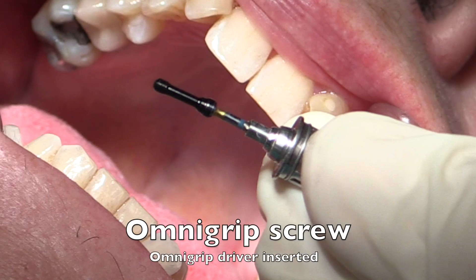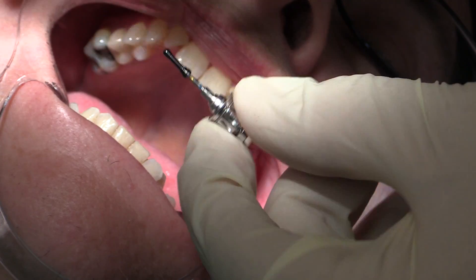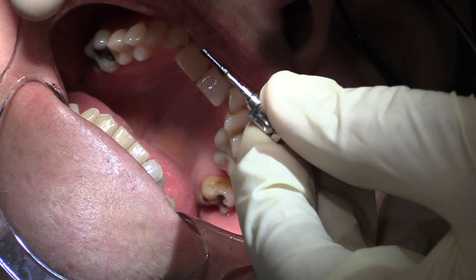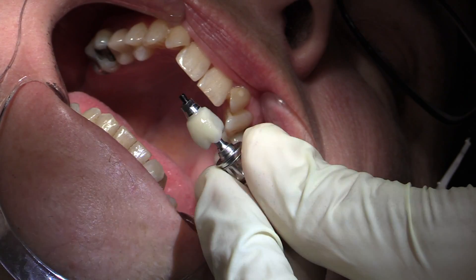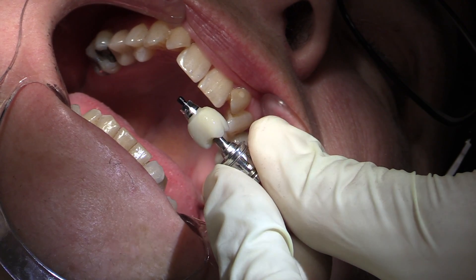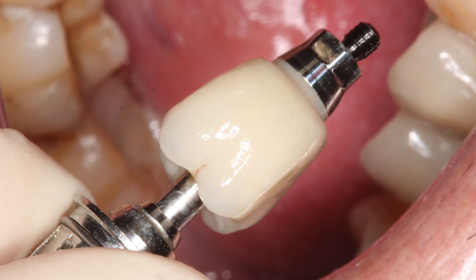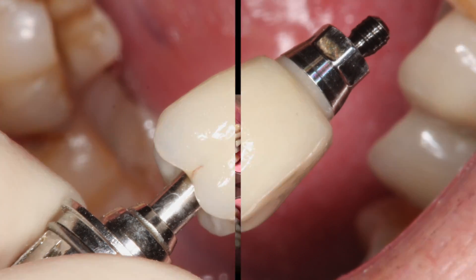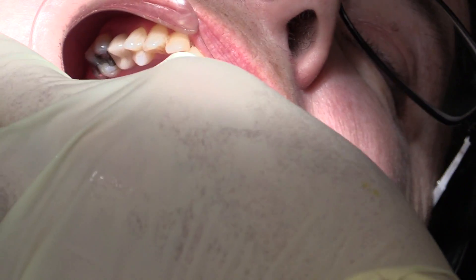Now this is an OmniGrip screw, which is a special screw used in this particular case. It's actually the regular platform screw but it still fits on the wide platform implant. When this goes through, it will hold the assembly together — the zirconia is held on the titanium adapter which is going to go into the patient's mouth. So it's not held together by cement; it's held together by screw pressure.